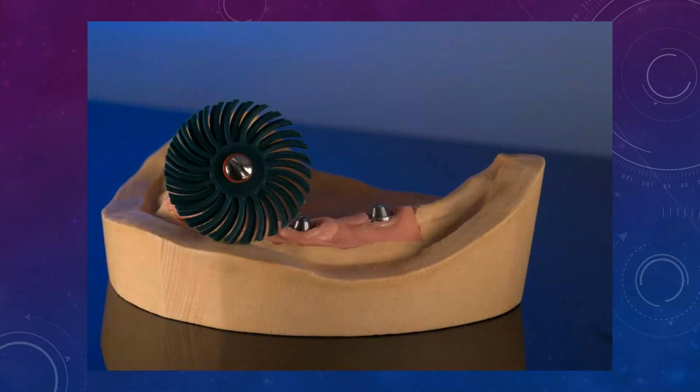But when you're doing your conversions, if you have a soft tissue area, make sure you smooth it down so the denture will actually push on the soft tissue, making it like a tissue form. Because this is the best time to do that. If you try to do it with a final prosthesis, it's going to be problematic. So when you're working with the immediate denture, make sure you create nice pressure on that area so you have a flat or concave tissue surface, making the denture flat or convex and way more cleansable. So that makes it very important to do that.